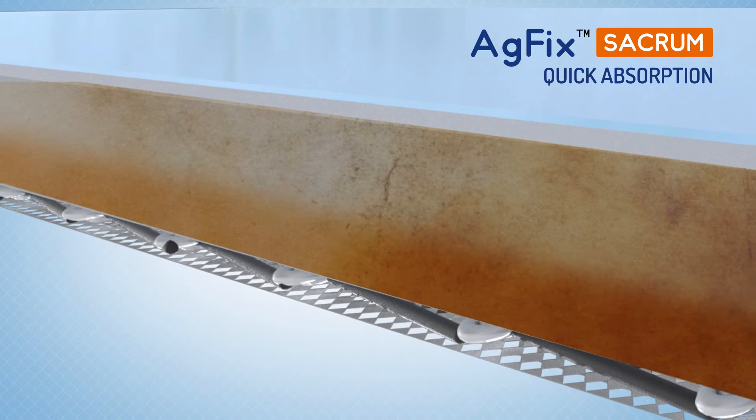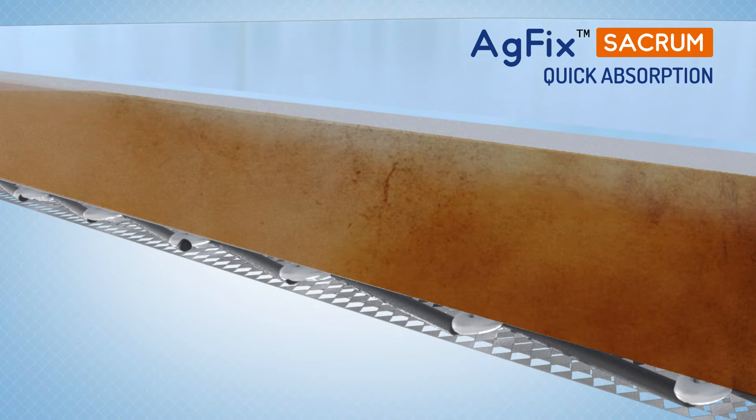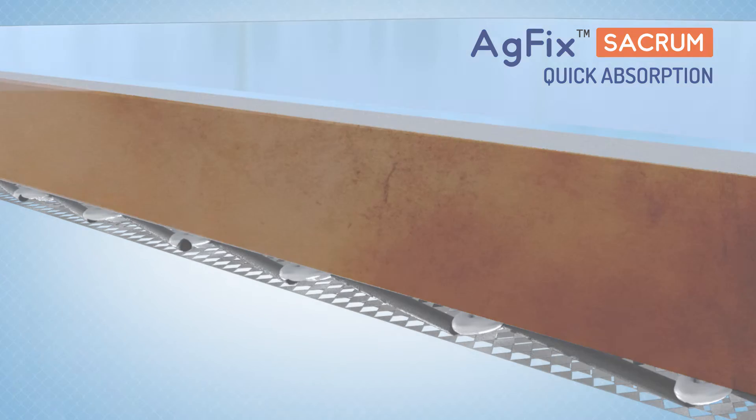The hydrophilic foam pad has excellent fluid wicking ability and reduces risk of maceration while creating an ideal environment for moist wound healing.